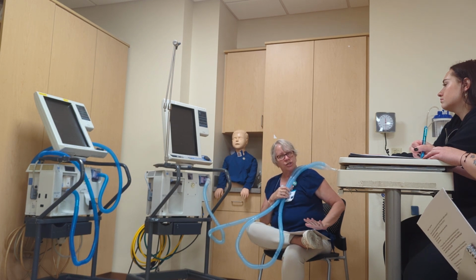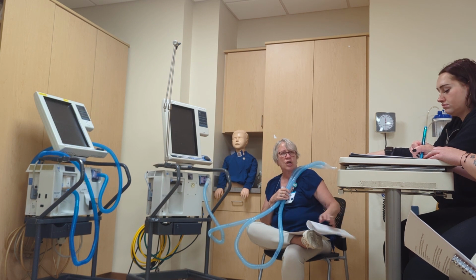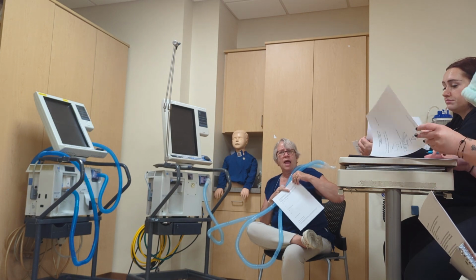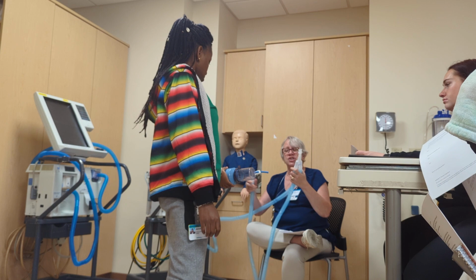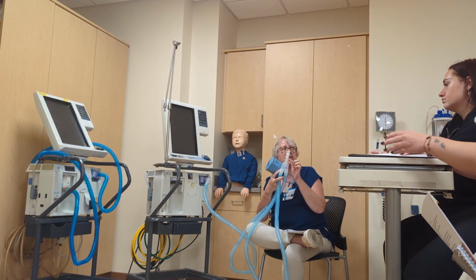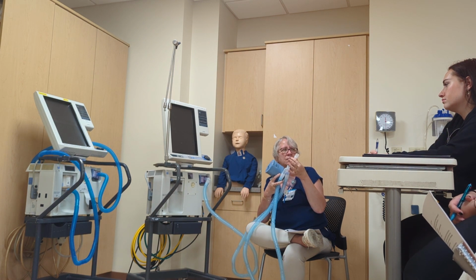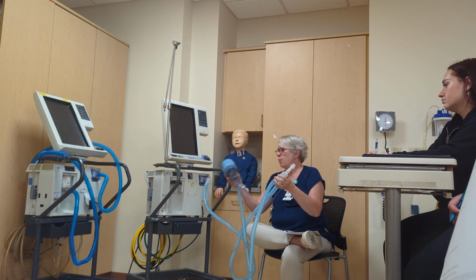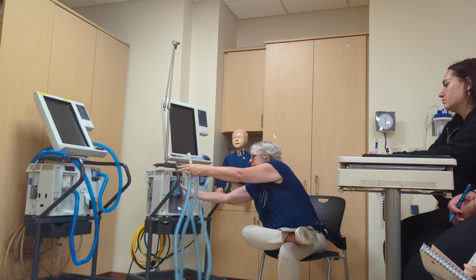So that's your circuit. That's the basic pieces of all circuits. You might find additional pieces like MDI ports, HMEs. If I do an HME on here, I would put it at the patient Y and the patient adapter. That's where I would do an HME. But that is the basic components of your circuit.